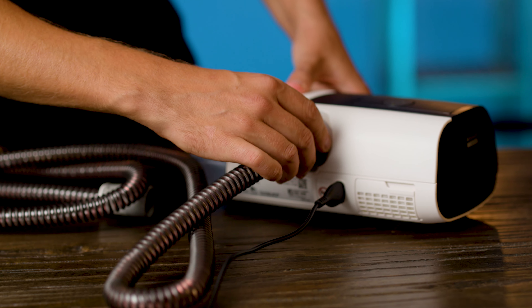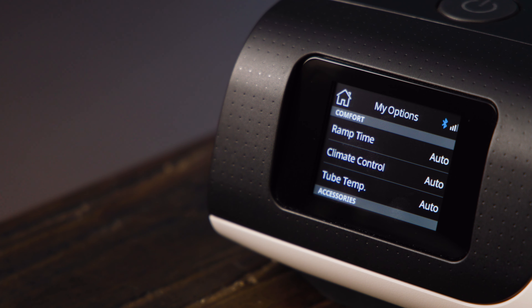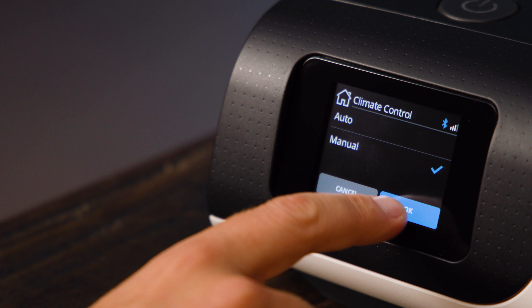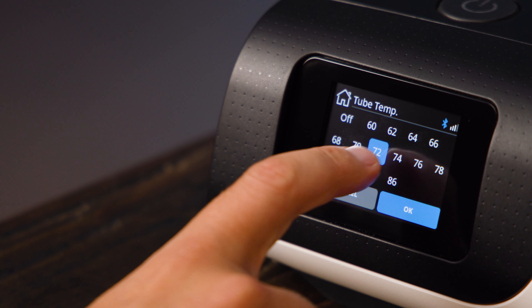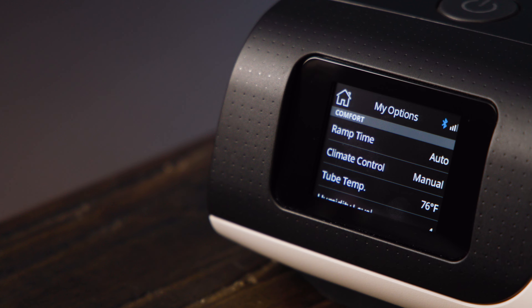However, if you have climate line tubing, then there will be two options here instead: climate control and tube temperature. Leaving these on auto will mean the tubing will adjust its humidity and temperature levels according to the ambient humidity and temperature in your room. The point here is to provide suitable humidity while avoiding condensation forming in the tube, which can lead to water sloshing around. Later, if you want, you can manually set the tube temperature and humidity levels if you find the automatic algorithm isn't working for you.